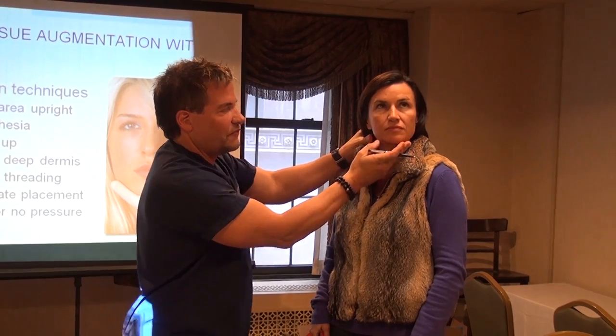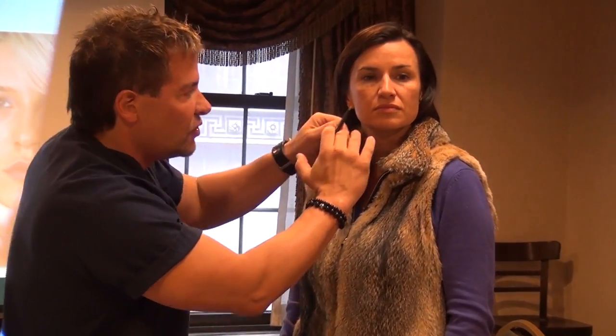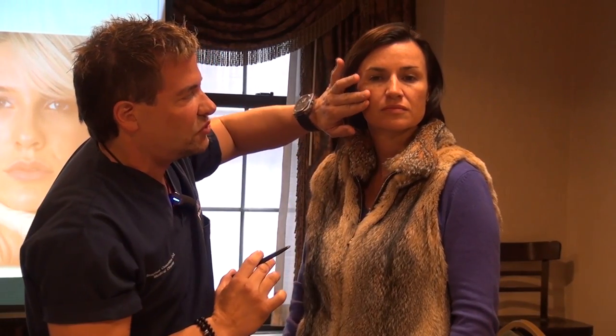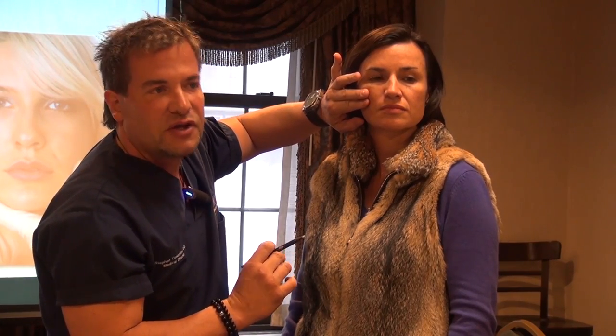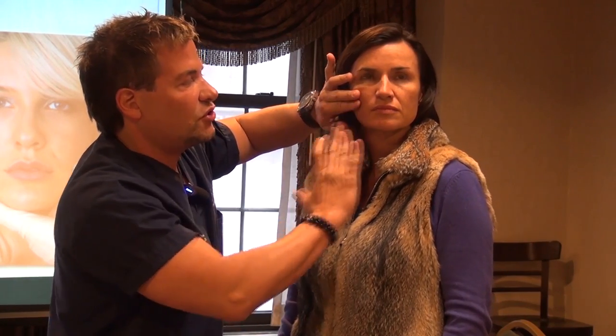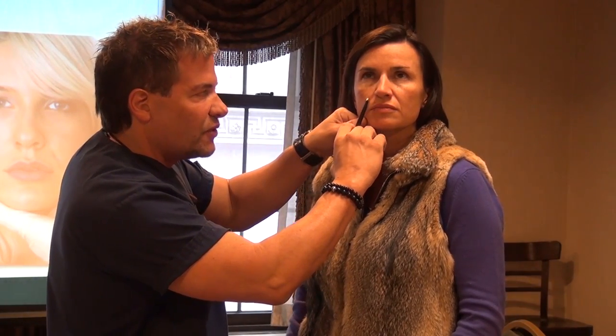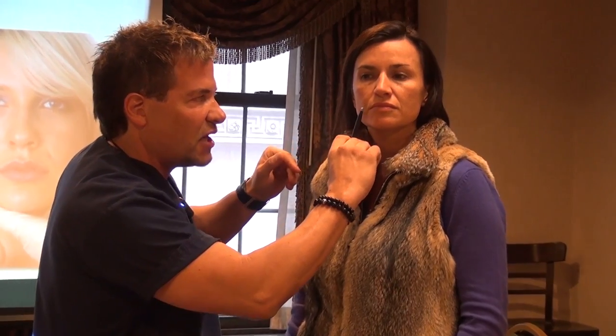You want to be very meticulous. Look closely and see the defect. What you don't want to do is push the skin back — I see that a lot. You don't want them lying down because you won't see the fold. What we're doing with the needle is called linear threading — you advance your needle and syringe into the fold and lay the product down as you're pulling out. That's the linear thread technique.